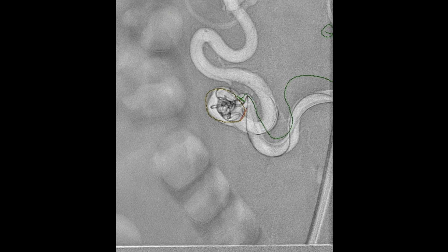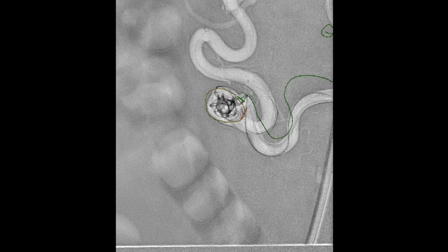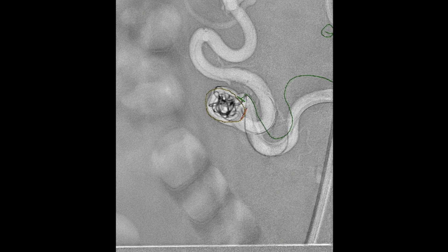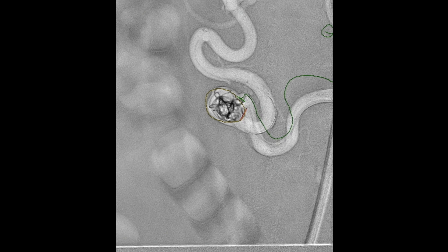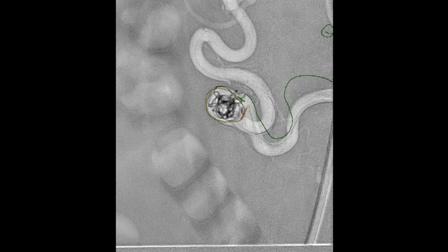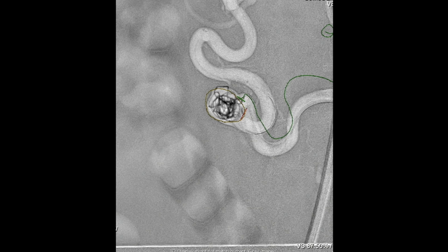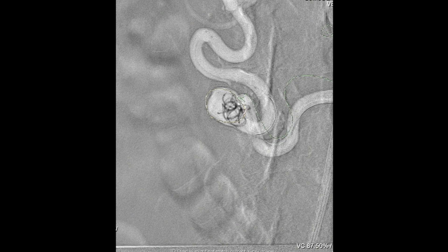Because you've got the safety wire distal, you can be fairly aggressive in actually packing the aneurysm. Numerous different coils were utilized in this situation. Once you place a coil, if need be you repeat the angiogram and place more coils. You still have the option, once the stent is in place, to put more coils in. But we needed that support to get the stent around the corner.